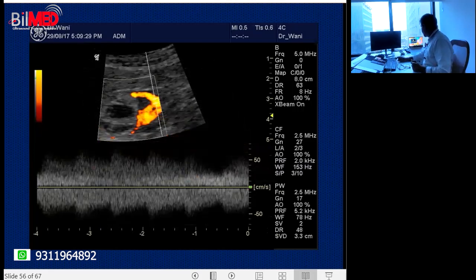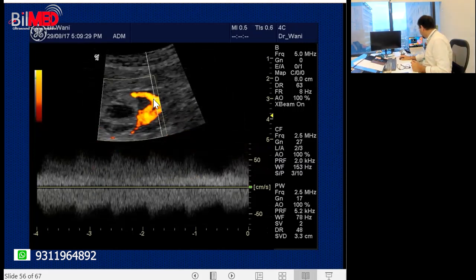So when I put the color on this, I am seeing now the flow, not this, the pulse flow. I mean, what is this called? This is called the placental flow. Put this in your mind and paste it over there. If I take a color flow from the gestational sac, it will show me a low resistance flow. This is called placental flow. Placental flow. So this is diagnostic of this thing being a gestational sac and not the corpus luteum.